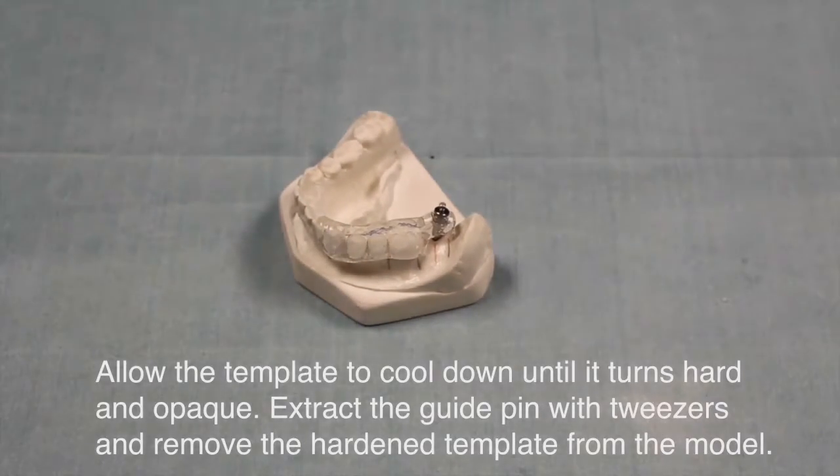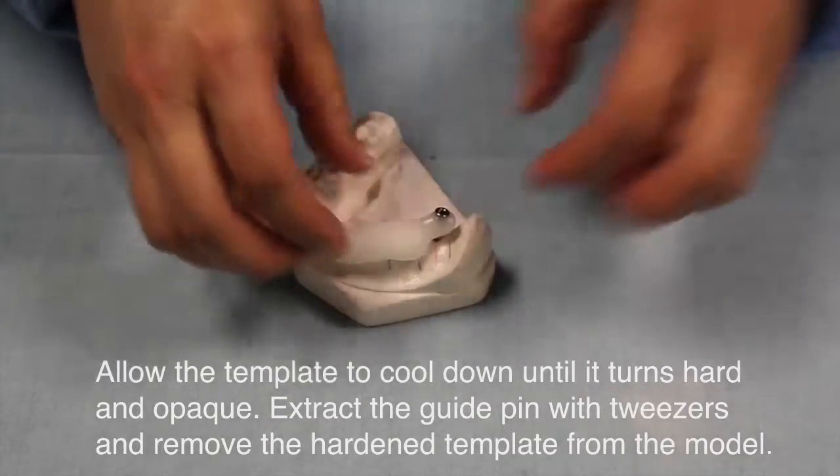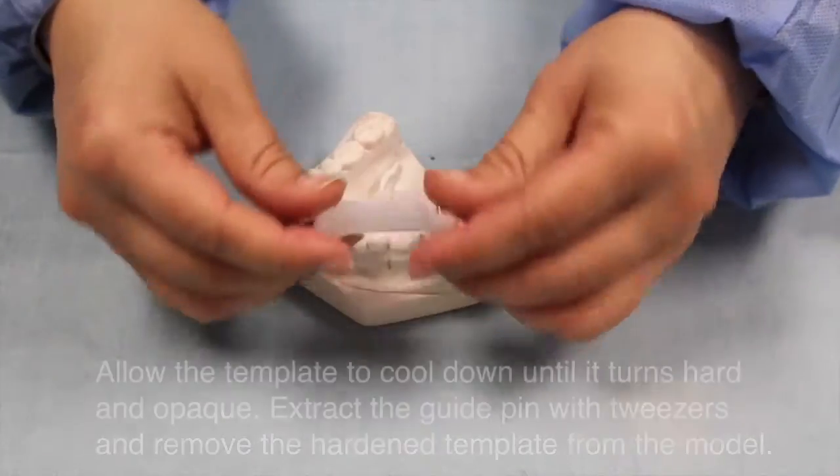Allow the template to cool down until it turns hard and opaque. Extract the guide pins with tweezers and remove the hardened template from the model.